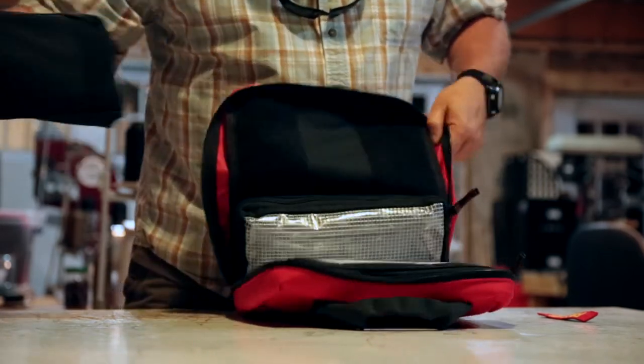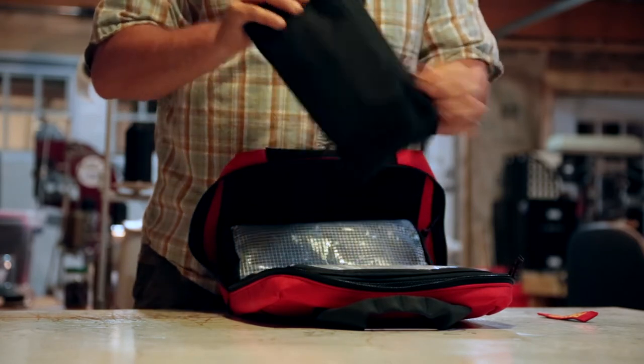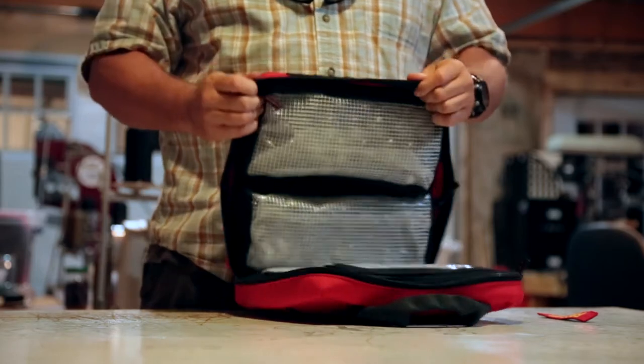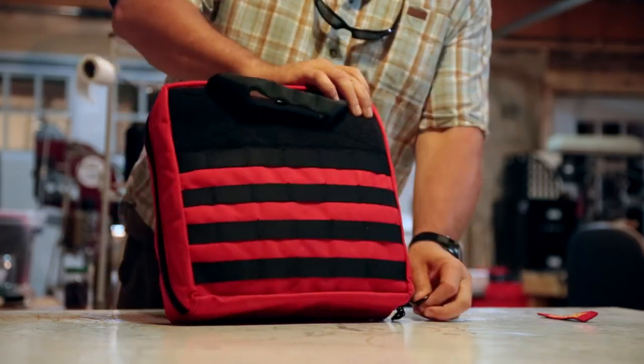You can set it up like that. Each one of these velcros out, so I can take it out and grab whichever pouch I need. I can kit it and organize it how I want it and throw it back in here and zip it back up.